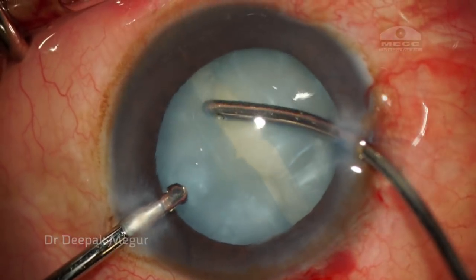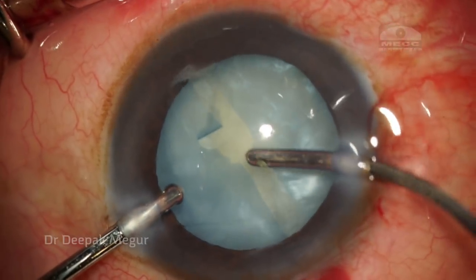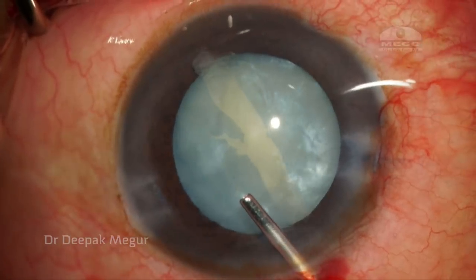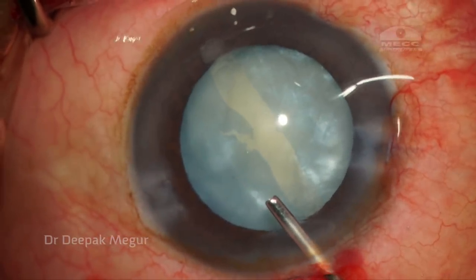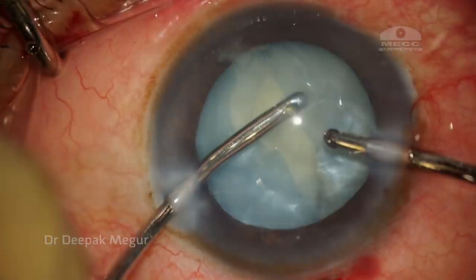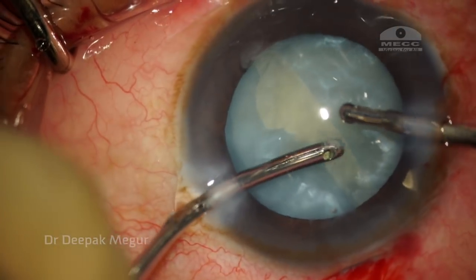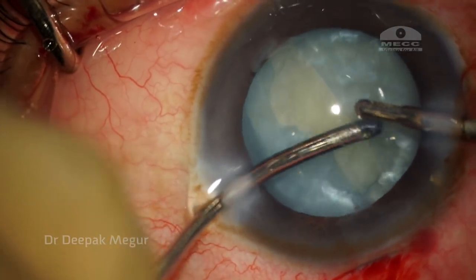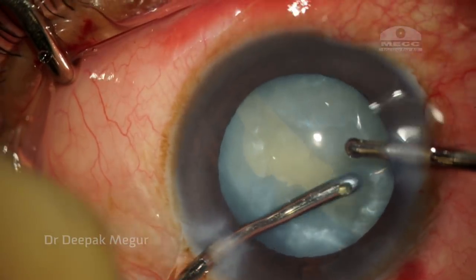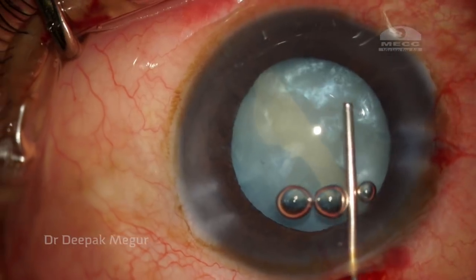So I'm just trying to aspirate the swollen cortex. The anterior capsule is very thin, and in this maneuver, the capsule gets torn a little bit. So after forming the anterior chamber with OVD, the small tag is torn off. Again, I'm proceeding with decompressing the bag from the other side. So once I feel that it is enough, I proceed to enlarge the capsulotomy to an adequate size.